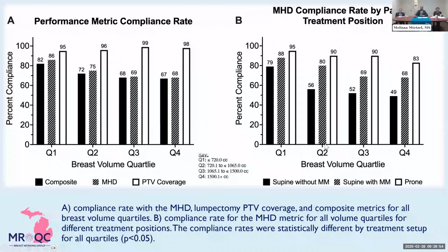However, prone outperforms supine with or without motion management quite significantly, and it is more drastic in patients with larger breast sizes. Supine with motion management is a good technique that does outperform supine without motion management, but it is not as good as prone when it comes to meeting the mean heart dose metric within this patient population.